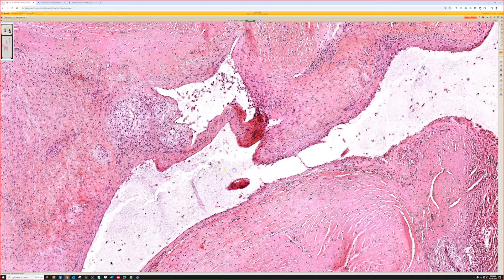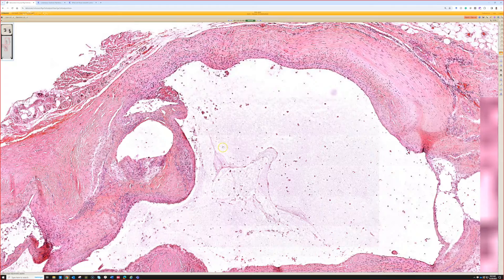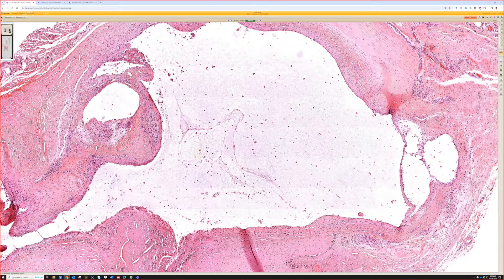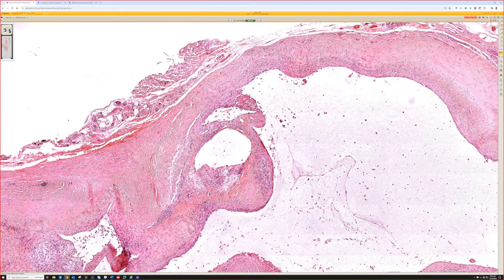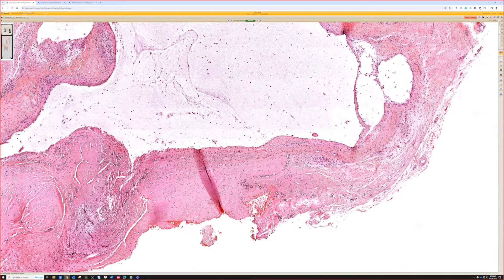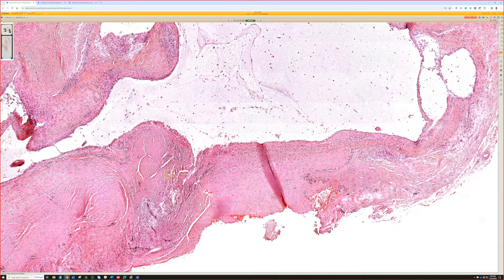There can be other reasons for hemorrhage and trauma in these cysts. When you get a lot of hemorrhage and trauma, the ganglion cyst looks quite different - with reactive change, granulation tissue, mixed inflammation, and abundant fibrin - and it can begin to look like a chronic bursitis. A bursa sac can look identical to a ganglion cyst; it really just depends on the clinical and intraoperative findings. If I'm not sure, I'll say 'dense fibrous tissue with focal synovium - could be ganglion cyst or portion of bursa, depends on intraoperative findings.'